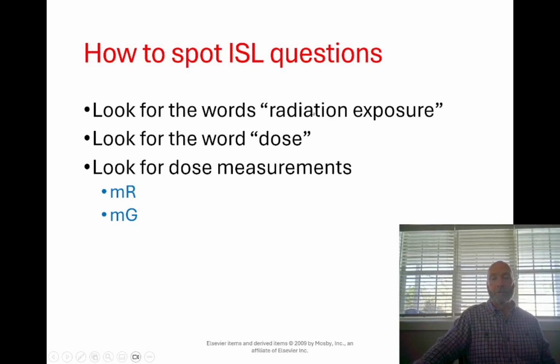So what you're going to look for are, your radiation exposure at 1 foot is so much, or your dose at 1 foot is so much. And also look for the dose measurements of milliroentgens, milligray, things like that.